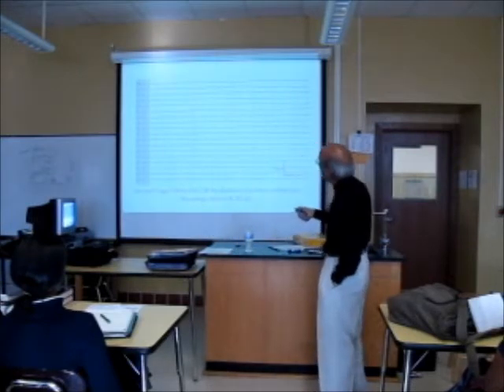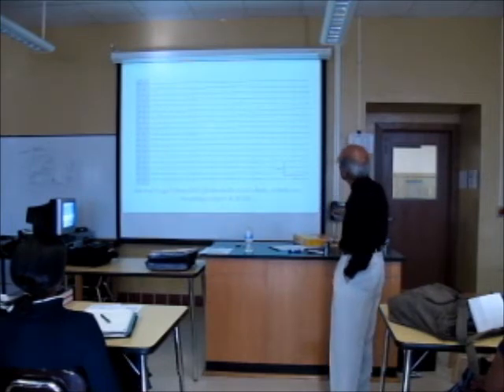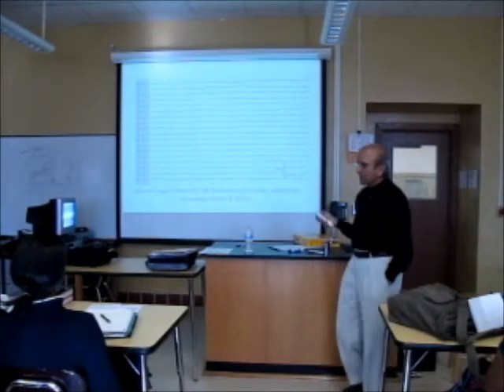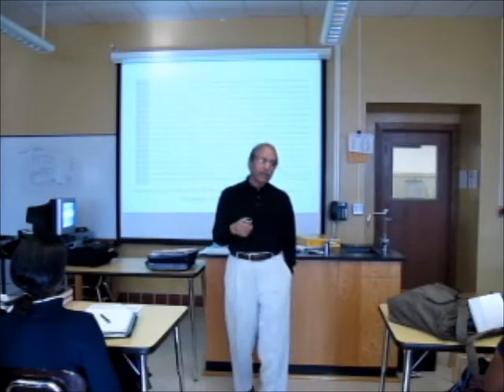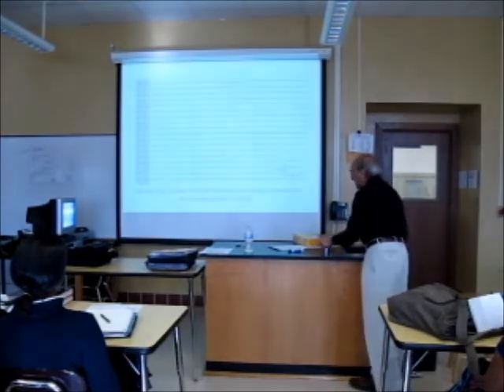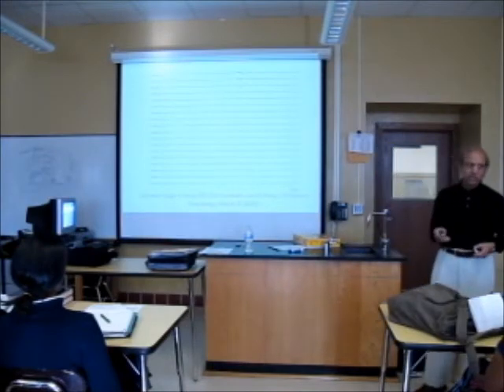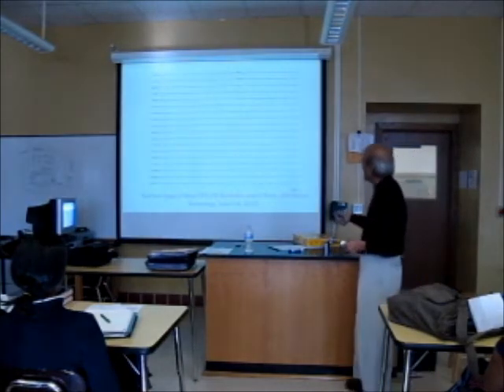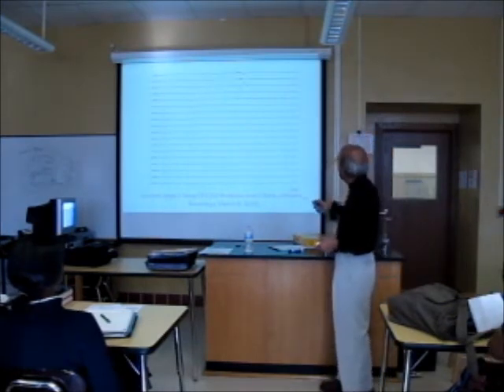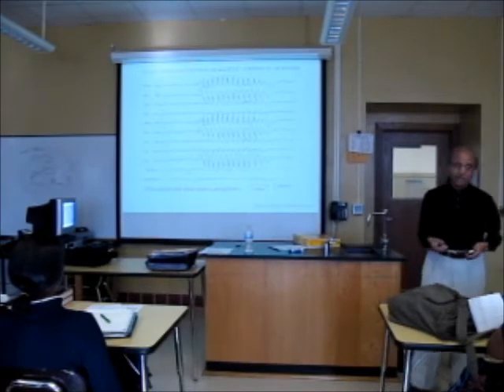When we become drowsy, alpha activity first slows down, and then it disappears and is replaced by slower waves. You see these waves, the theta frequency 4 to 7, delta frequency is up to 3 hertz. Okay, as we fall asleep, we go through different stages in sleep, and we can tell by looking at the EEG. This is stage 2 sleep, for example, and around the center part of the brain we see what we call vertex sharp waves. But we are going to see some abnormalities.